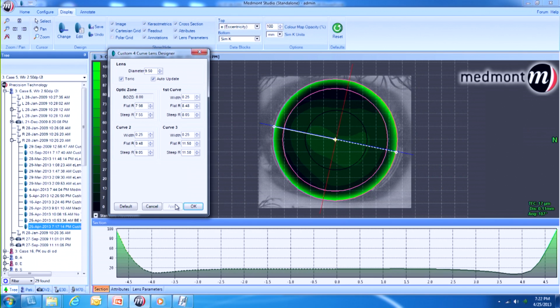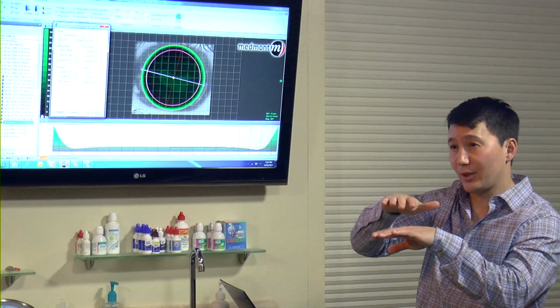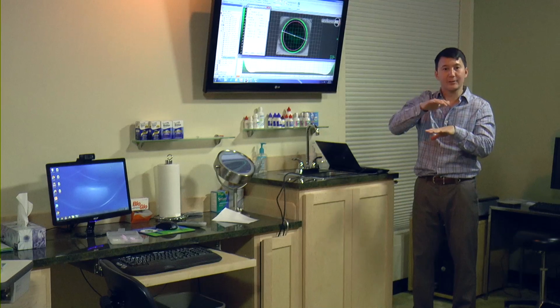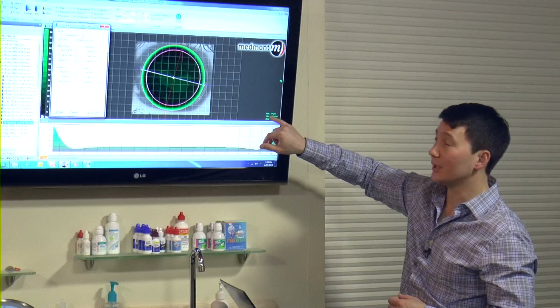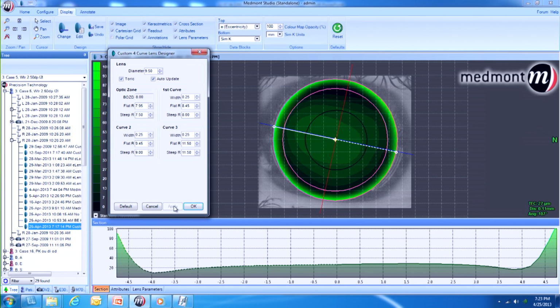First thing is we click our cursor in the center and it says we have 17 microns of fluid. And we know when we're below 20 microns, the density of those molecules isn't such that we're going to be able to pick them up. So in other words, we can't say the lens is definitely clearing the corneal apex and we have a healthy relationship. So we must steepen up the lens to get this lens above our threshold to pick up fluorescein. So I'm going to steepen the two base curves a quarter step, one step, and now we're up to 27 microns. So rule number one that we teach our students, have appropriate apical clearance, and we've met that.